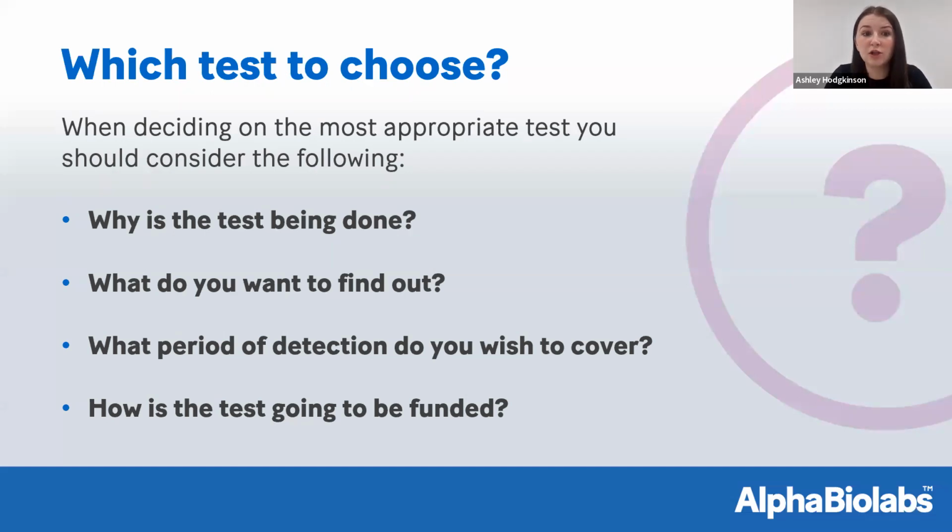So which test do you choose? We've come to do a referral. What are the things that we need to consider? And we covered this a little bit earlier, but the main thing that you need to figure out is, what am I looking to get out of this test? Why is it being done? What sort of time frame do we want to cover? What do we want to test for? And how detailed does our report need to be?